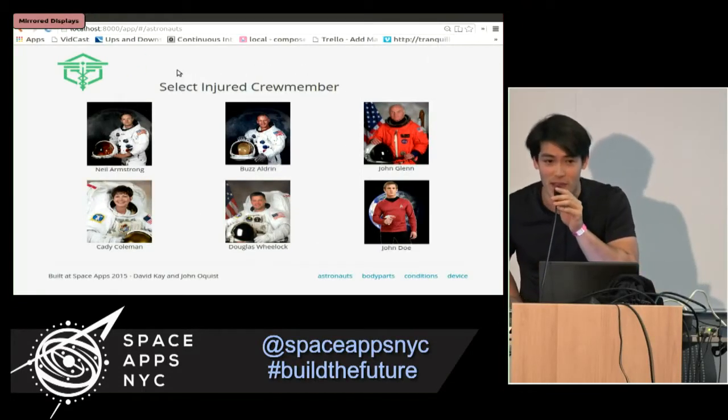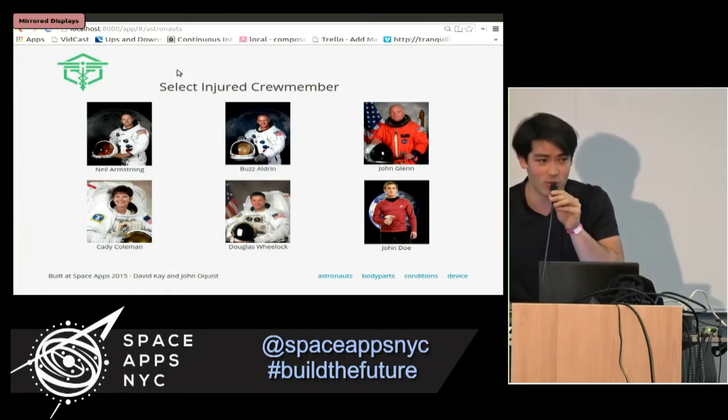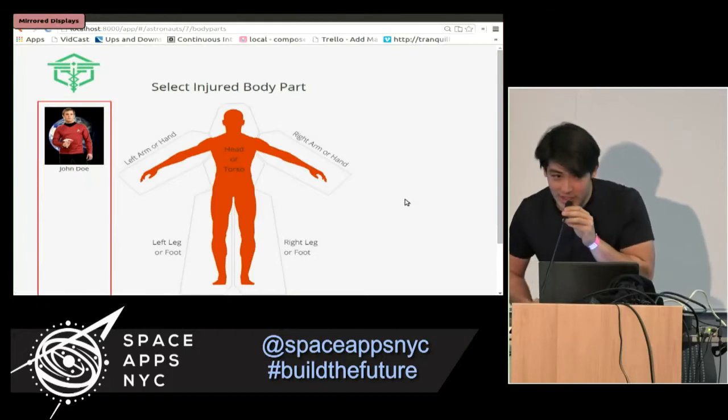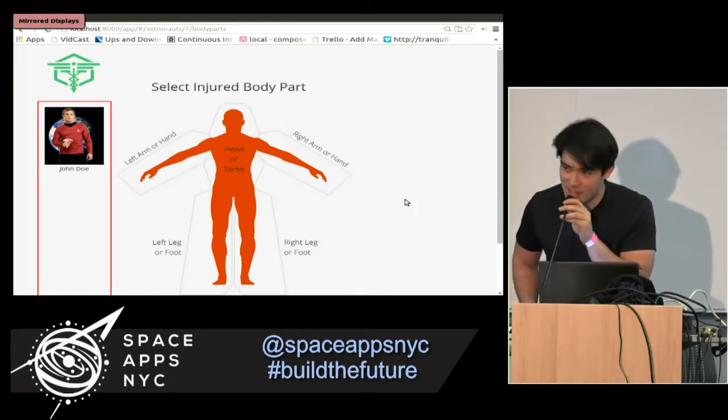We've fired up MediPrint. We've got a UI where we can select the injured crew member aboard the ISS. Today, Buzz and John are off the hook, but poor John Doe over here got injured during the course of the mission. It's that red shirt, I'm telling you.